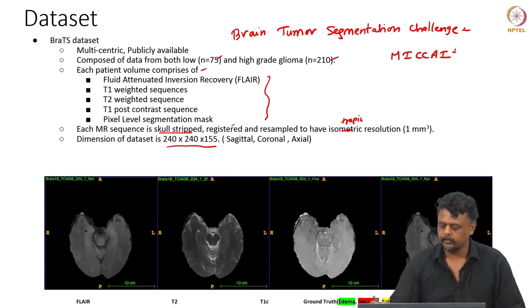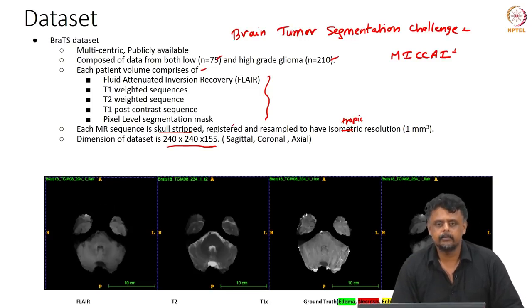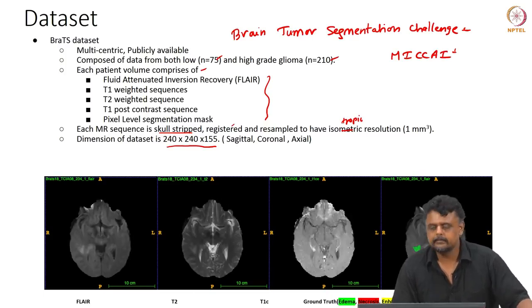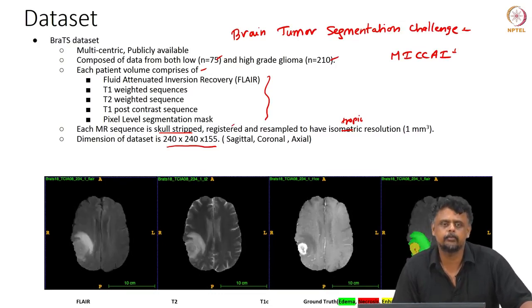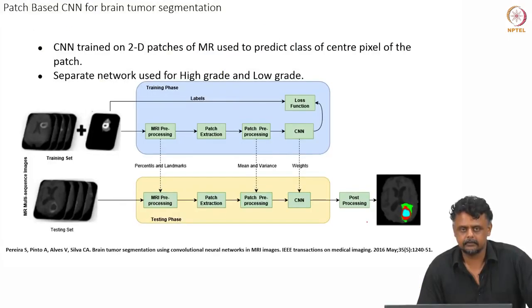and it is also shown on the right here. Each of the tumor classes, with the intra-tumor classes, is marked by a different color, and the task is to obtain a similar classification by using some machine learning technique or other image processing techniques. So, we will typically explore the CNNs that have been very successful at this task.